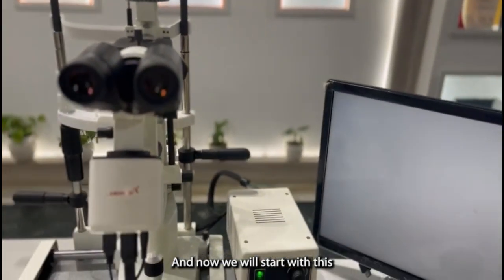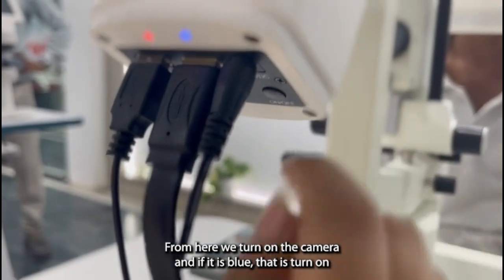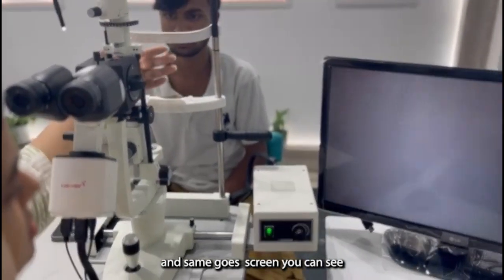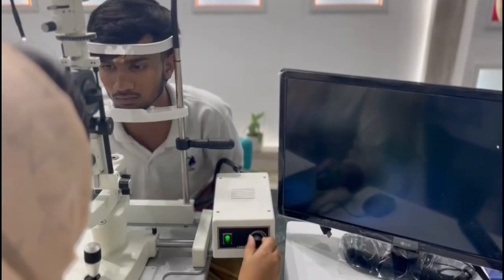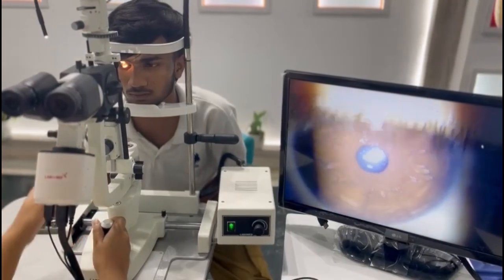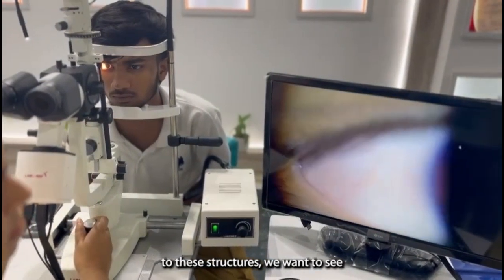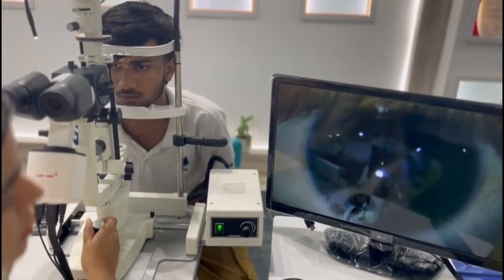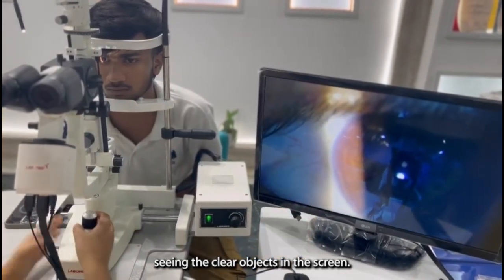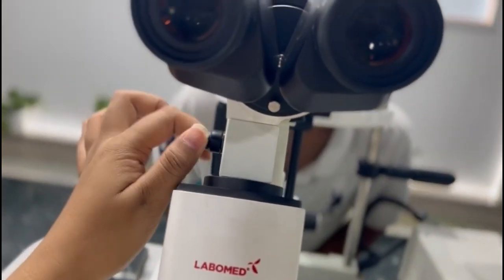Now we will start with the demo of a patient. From here we turn on the camera, and if the color is blue then it is turned on, and the same goes for the screen. As you can see, according to the structures we want to see — if you are not seeing clear objects on the screen, you can zoom in and zoom out using this cursor given here.